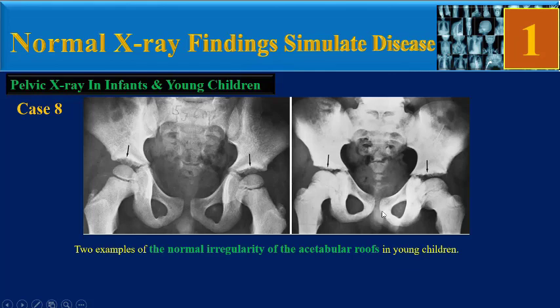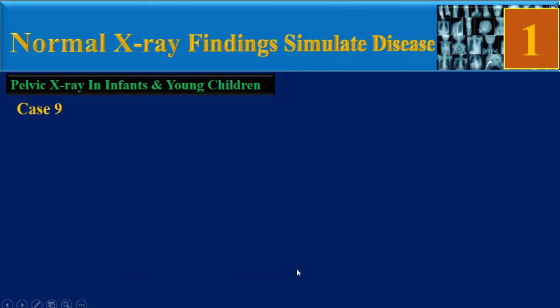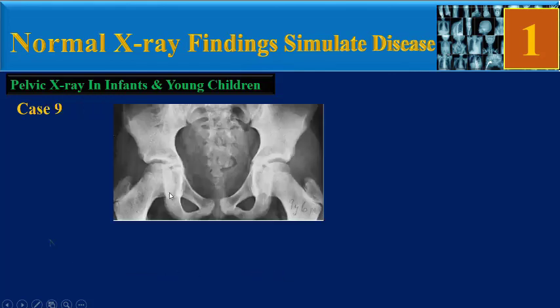Case 8: two examples of the normal irregularity of the acetabular roofs in young children. This appearance is normal between ages 7 and 12 years.